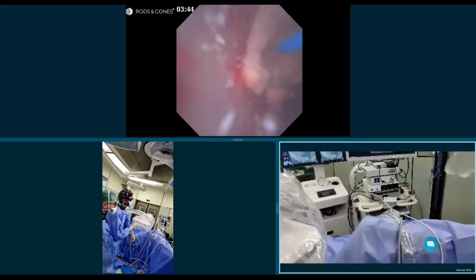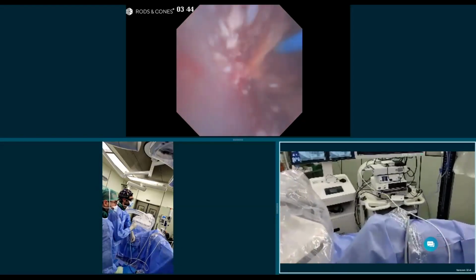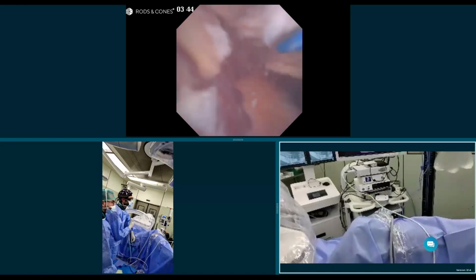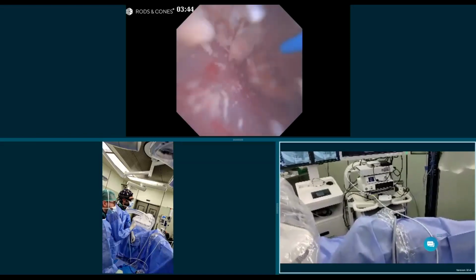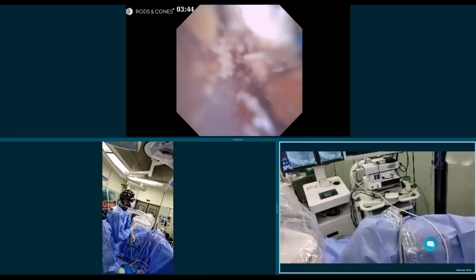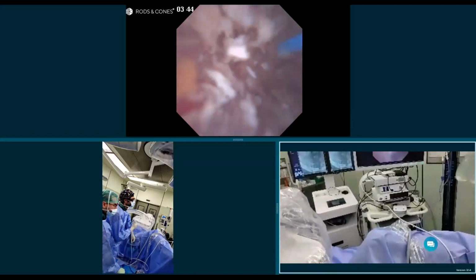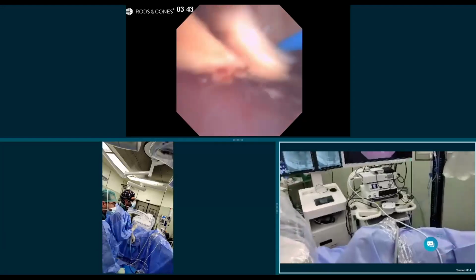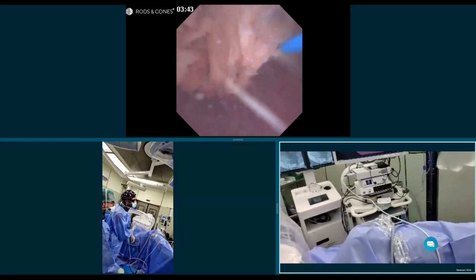I have the aspiration on hand. You can see that visualization is good. I'm going to dust this stone, and these stones that break very easily, which are struvite stones, you may need to do some popcorning eventually, because they just break in the middle of the dusting, as you can see here. So the strategy again was to relocate the stones to a non-inferior calyx where all the stones were, as you can see here. And with this, it was good to have all the stones in the same calyx, to dust and control them.